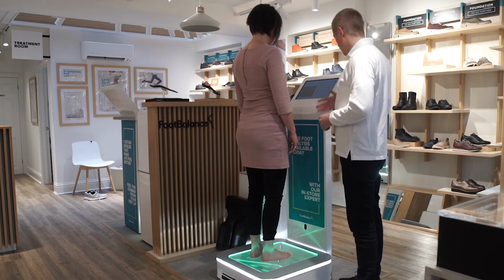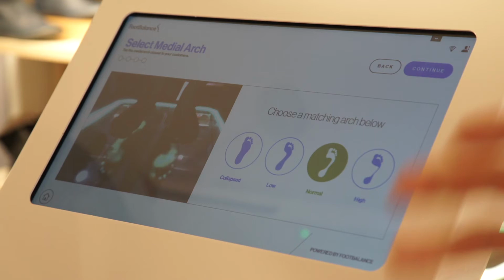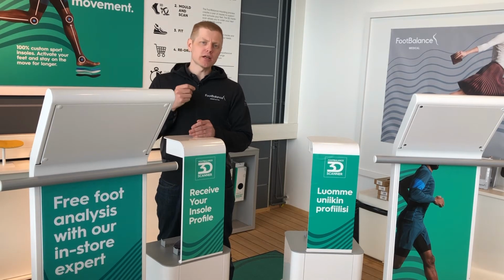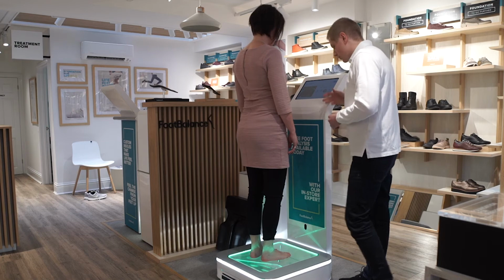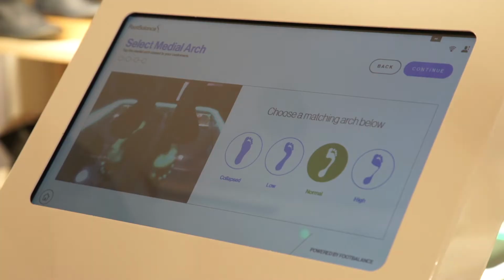We can show the example image of a normal arch and how the green color under the foot looks with the normal arch type. The green color shows us how the customer's weight and pressure is deviating in the bottom of the foot. Take a look then to the screen and podoscope and analyze which of the example images is the closest to your customer's arch type.